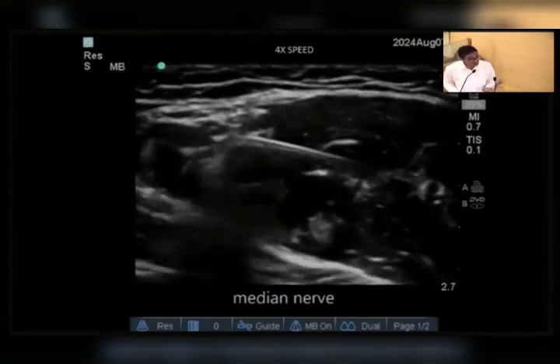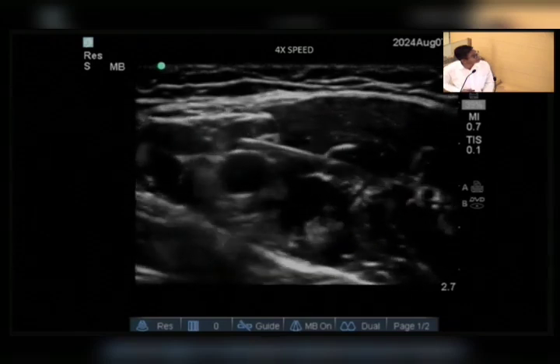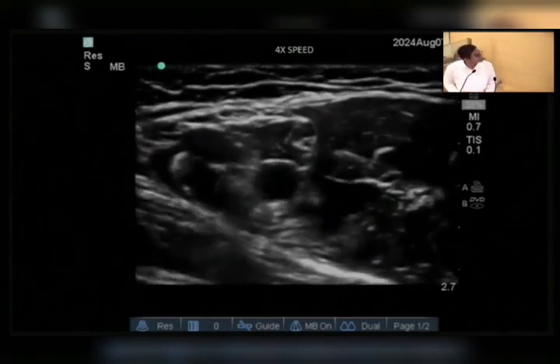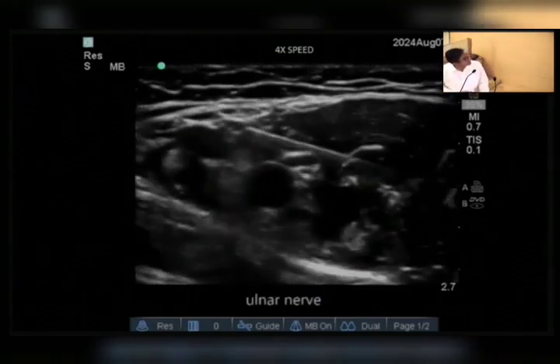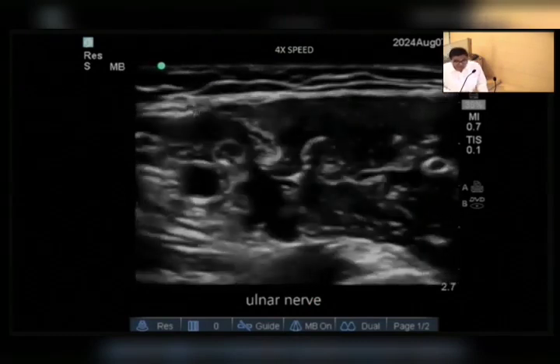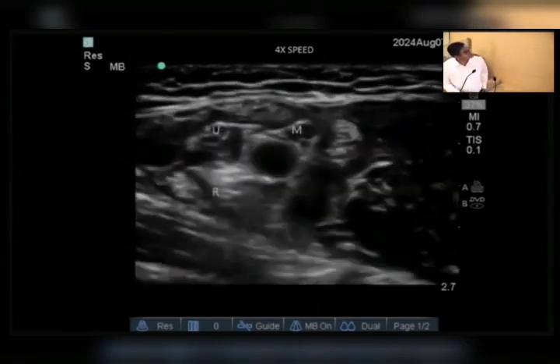It all depends on drug distribution. So somewhere you will find the ulnar nerve. This is the median nerve, and most of the time nerves are visualized very well after drug injection, specifically the radial. And if you can visualize, this is the medial cutaneous nerve of the forearm. This one.